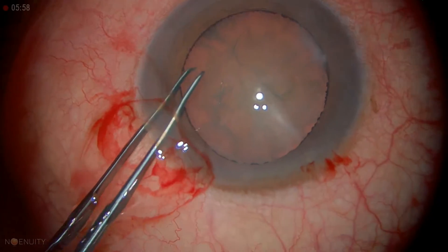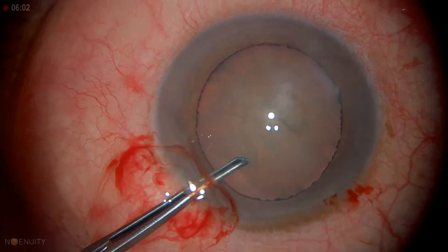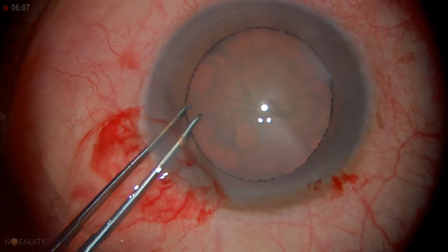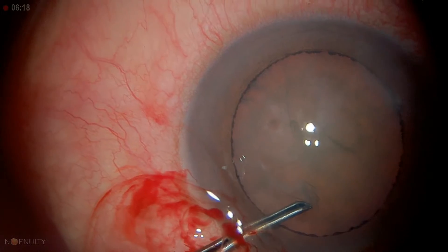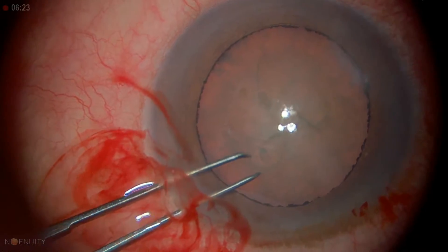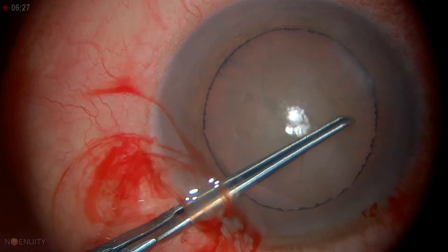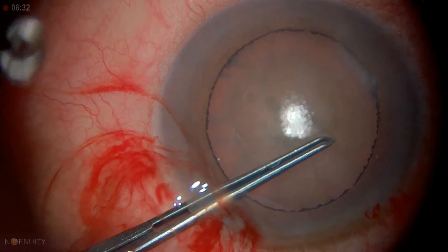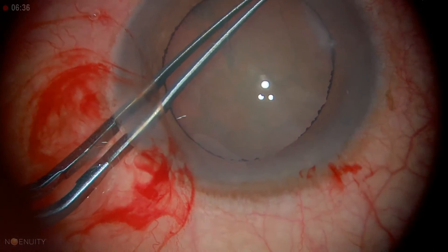I'm keeping this turned over. It's sticking a little bit centrally, so I'm just going to free it up and keep going around. And we have a nice round rhexis.